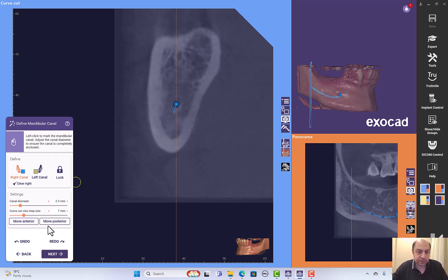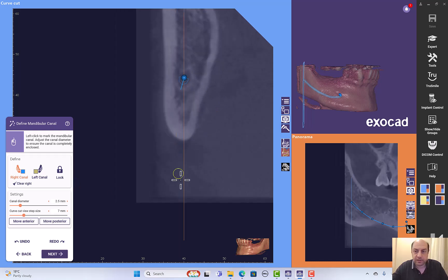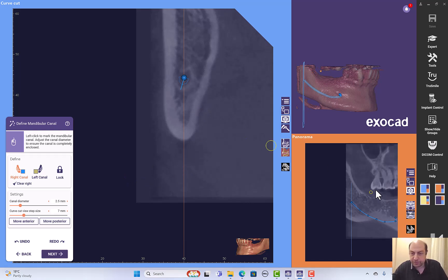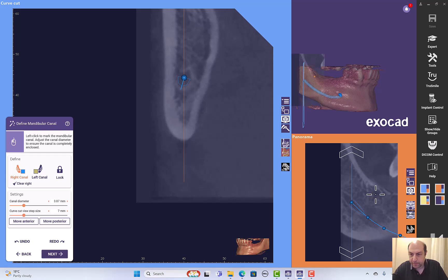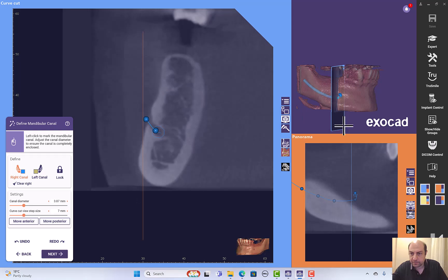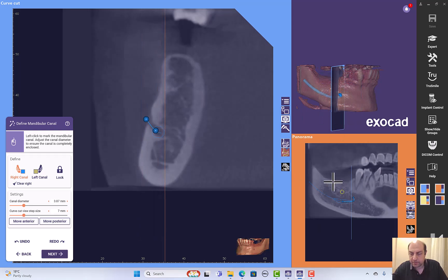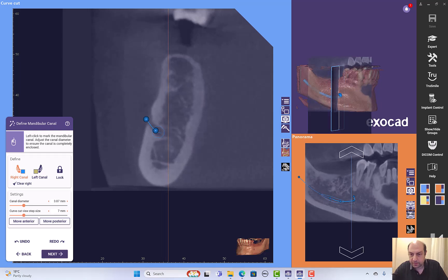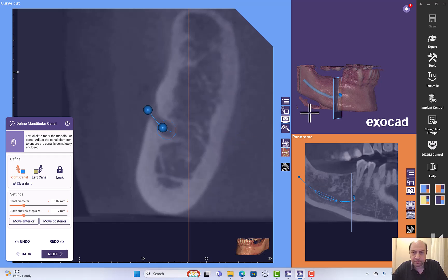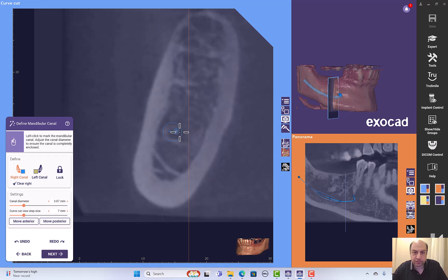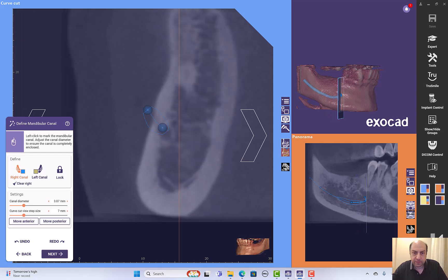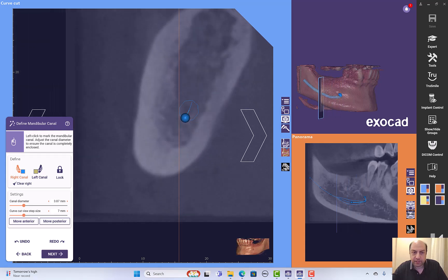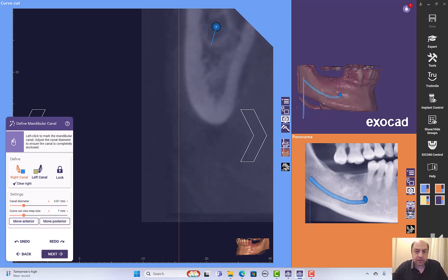Finally I can just again move posterior and place my final point. You can increase the diameter of the nerve from here. Let's see it from the panorama. Okay, let's revise the points, let's navigate, make sure that there are no missing points or points placed in the wrong area. Okay, looks fine. You can see it better here from this view.